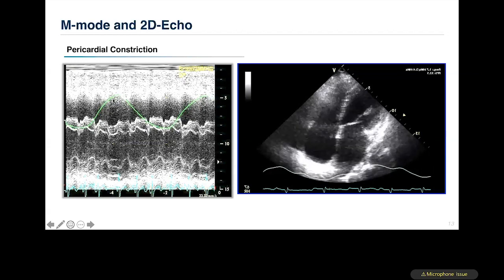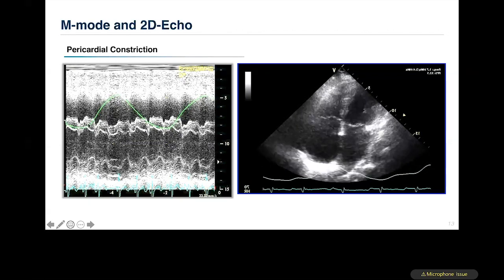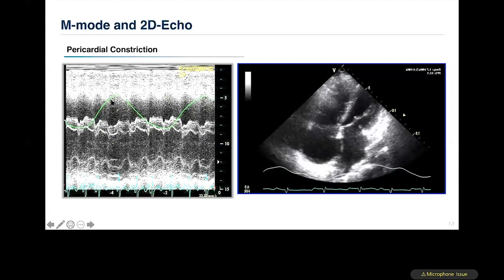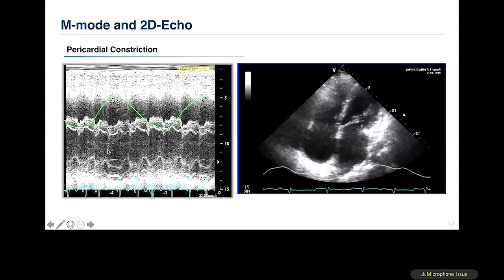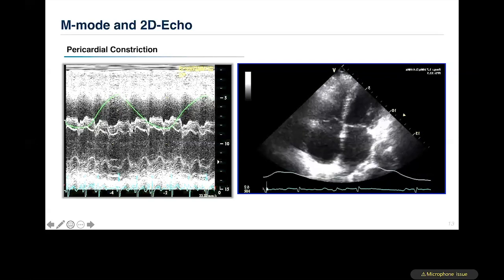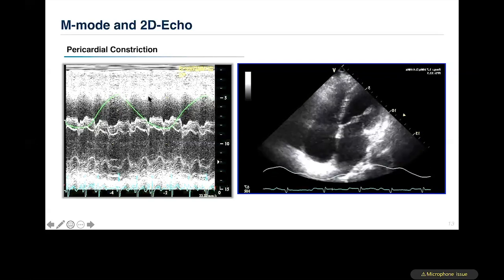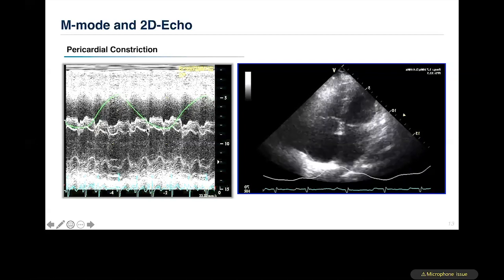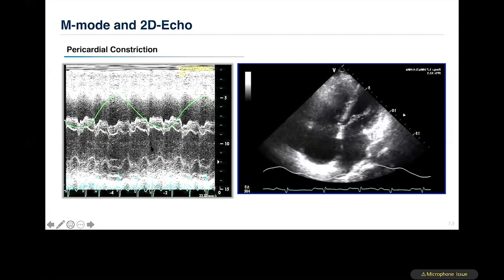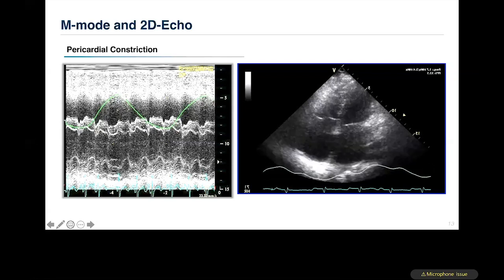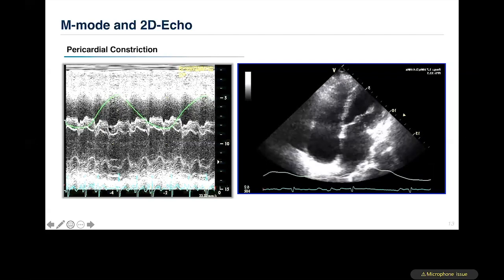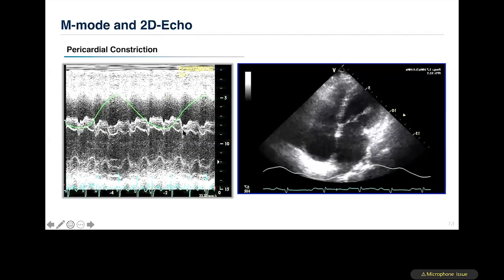During inspiration, RV volume increases, the RV size increases, and the septum moves toward the LV while the LV size reduces. During expiration, the LV size increases, the RV size falls, and the septum moves toward the right ventricle. In addition to this back-and-forth motion, there is an abnormal high-frequency motion happening in the septum.